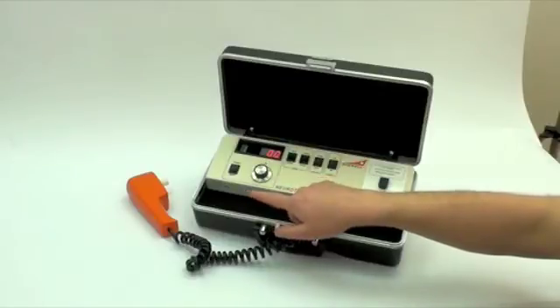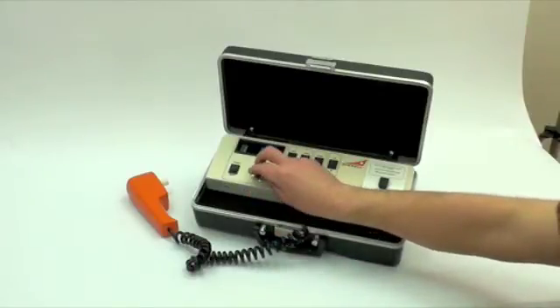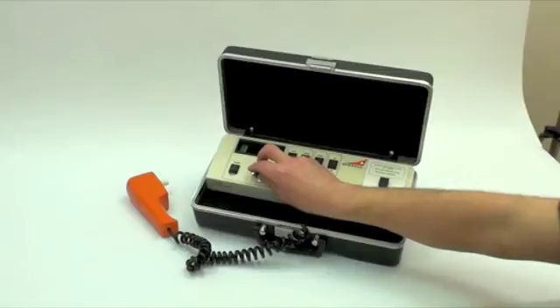Place the probe gently against the patient's foot, you turn the dial until the patient reports they can feel the vibration.